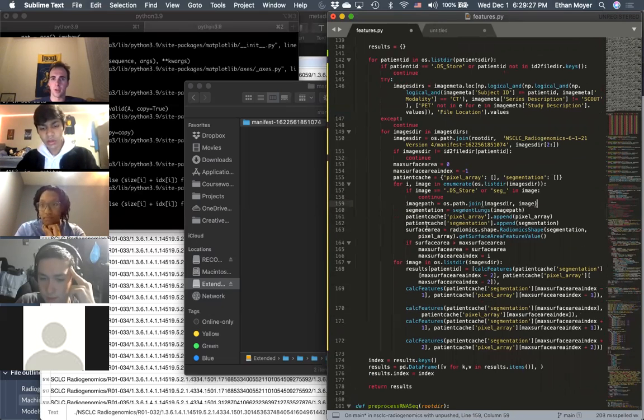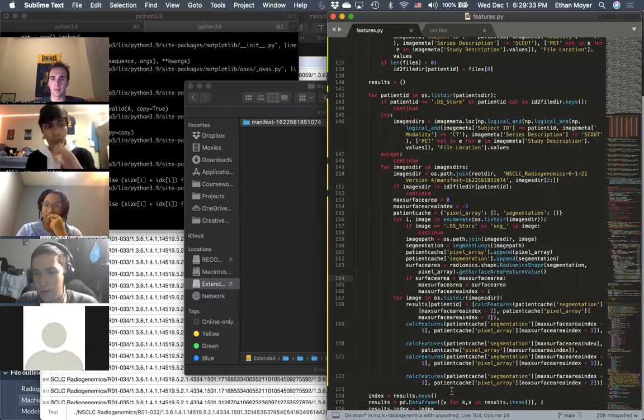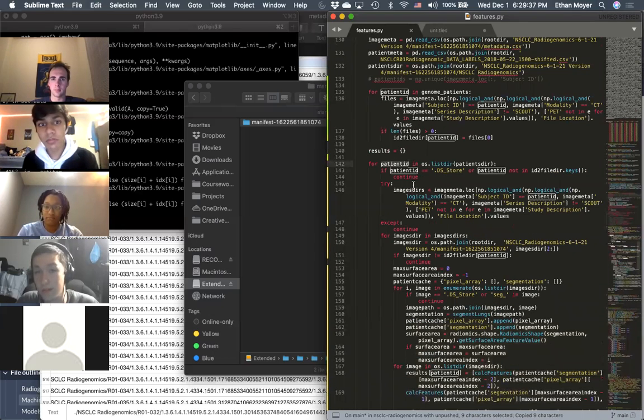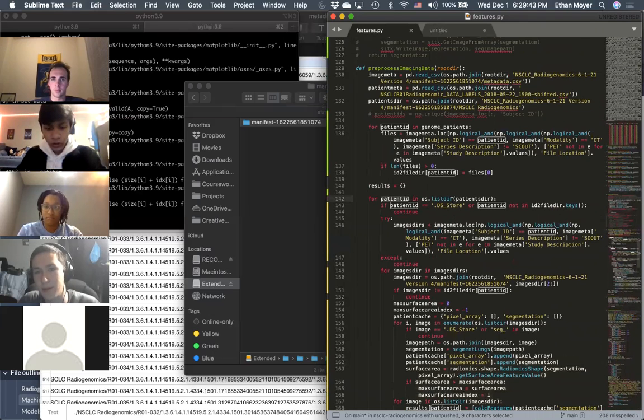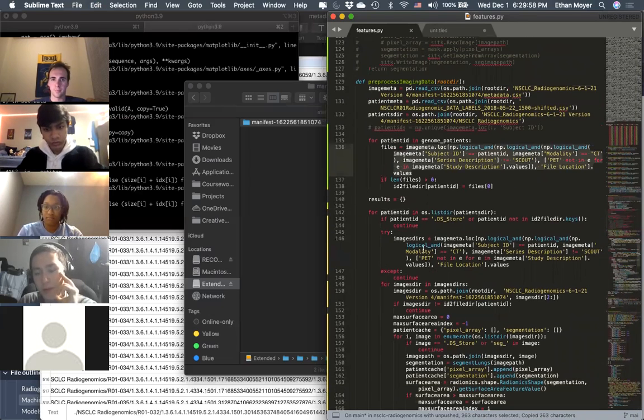And you'll just get one. So I think this would work actually, believe it or not. Are the segmented images DICOM files themselves, or are they like PNG images of them? They're DICOM files. You mean the segmented image that we made or that are already made? I mean, that we made. Yeah, they're DICOM. I'm trying to figure out what would be our input layer. Like what would be the shape of it?